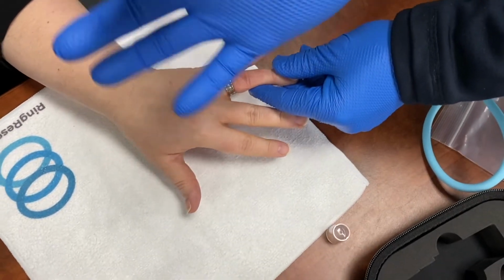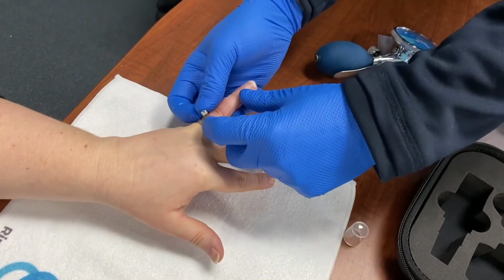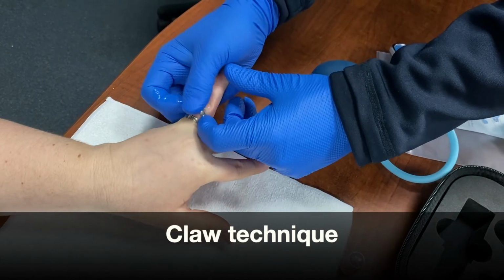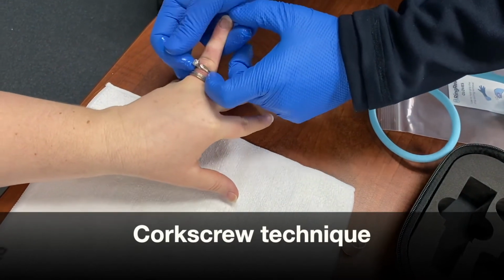I'm wearing gloves with texture grip. Allows me to grip that ring without sliding all over the place, and we're just going to start walking that ring off, okay? Now, with this ring band, sometimes I like to use a bit of a claw technique where I get my fingernail under there a little bit. It just helps me provide some traction as I'm using what I call the corkscrew method here. We're going to keep walking it forward.